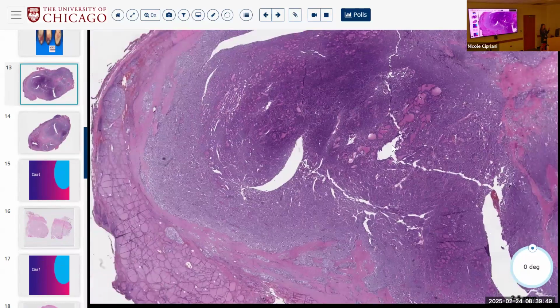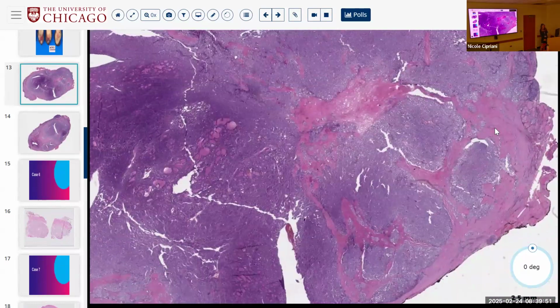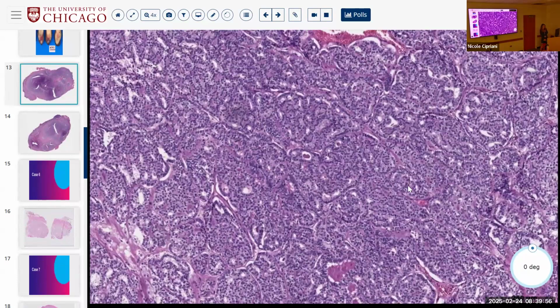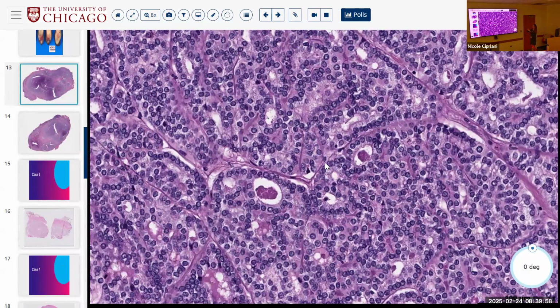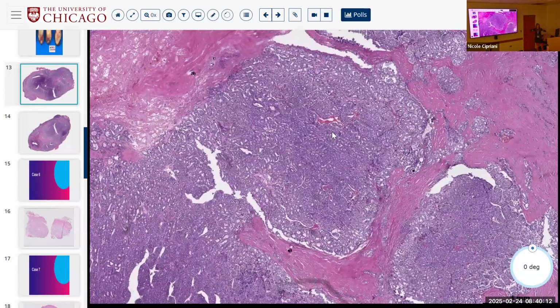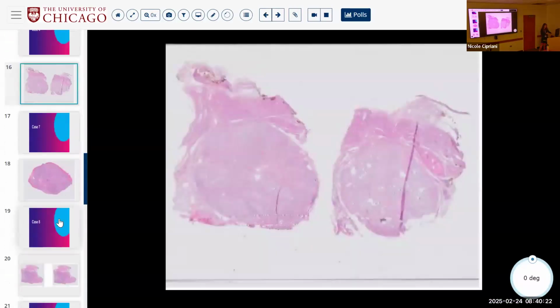So you have a highly infiltrative sclerosing growth pattern, like you think about with papillary. You have psammoma bodies like papillary, but you have a very follicular, kind of nested growth pattern without overtly PTC-like nuclei. Think about this NTRK tumor, and that's what this is. This is ETV6-NTRK3, okay? This is that one that I told you about on that chart. It straddles the line between BRAF and RAS, and the morphology mirrors that with hybrid features.